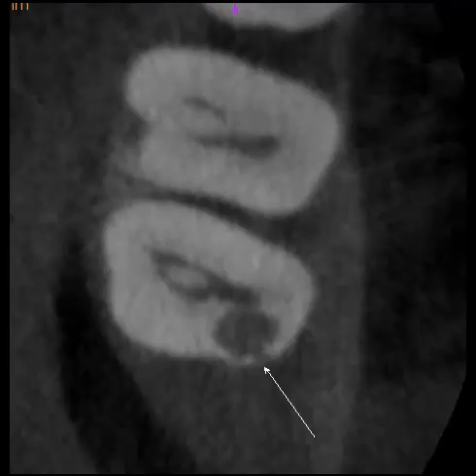Note this still capture from the CT where there seems to be a little tunnel opening. This entry point is very small, and unlike caries it doesn't represent a very wide, mushy area — so that is one of the distinguishing diagnostic characteristics between caries and resorption.